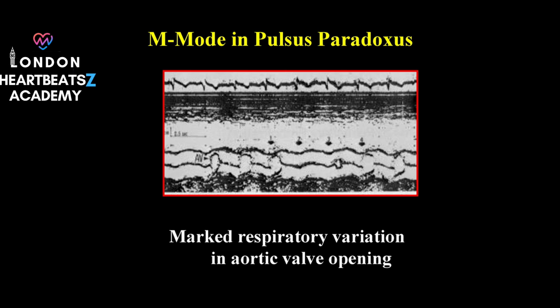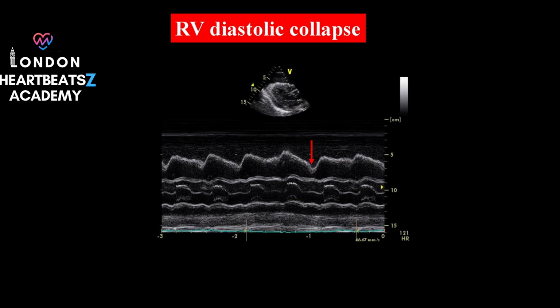So how does M-mode help us figure out the right atrial pressure? We can estimate it by looking at the size of the inferior vena cava, IVC, on the M-mode. The IVC is a large vein that carries deoxygenated blood from the lower body back to the heart. Changes in its size can indicate changes in right atrial pressure. So by observing the IVC on an M-mode, doctors can get a sense of the patient's fluid status and potential heart function issues. That's pretty clever.